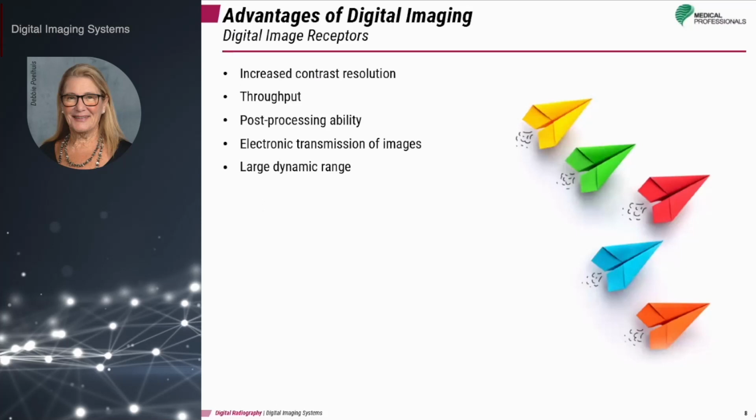And unlike film screen imaging, digital images allow for manipulation and enhancement in post-processing. Another real advantage is that images may be electronically transmitted for consultation with providers in other locations, including distant countries. Images can be viewed by many caregivers simultaneously, and they're not lost in that process.